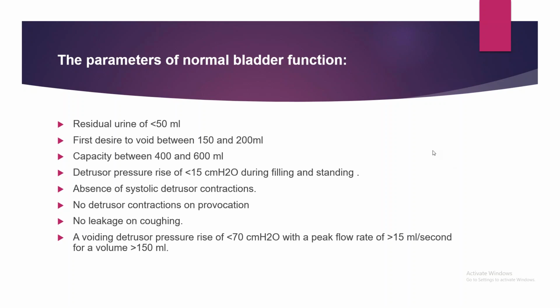They have given different values everywhere, so we can't follow any value as normal. They have given different readings from 50 to 150 as normal in different guidelines and different talks. Here, in this talk only, they have changed the volume values 2 times, and nowhere has any proper value been given for PVR. So we can't tell any exact value for this PVR, but they have given different values from 50 to 150.